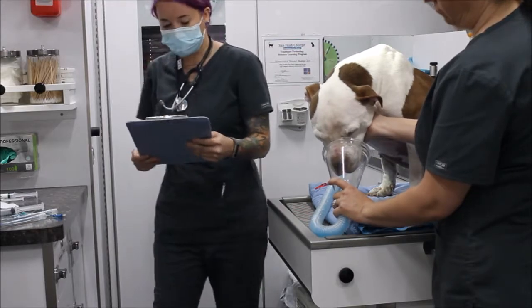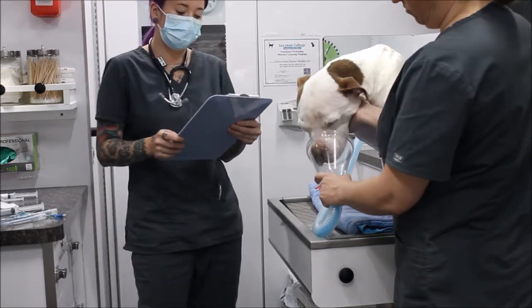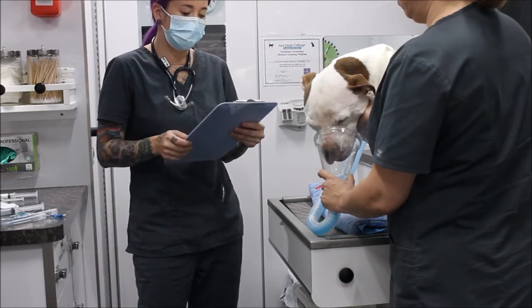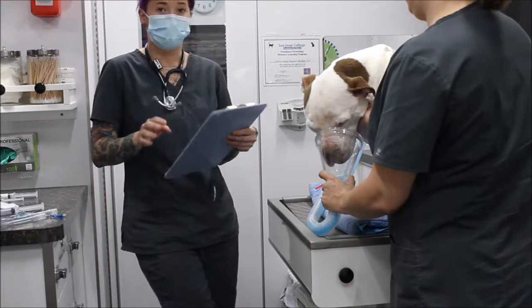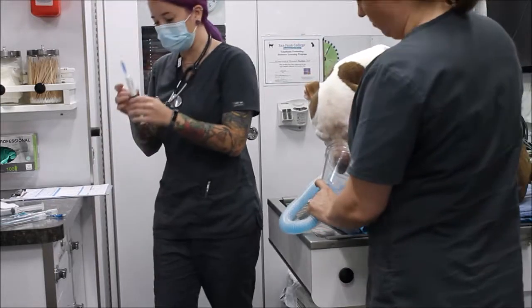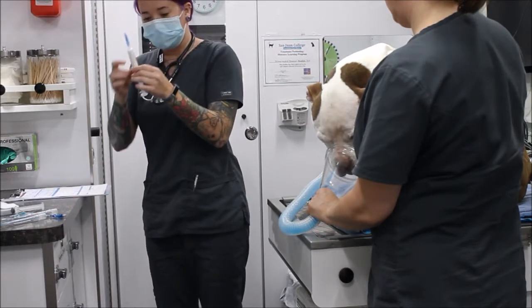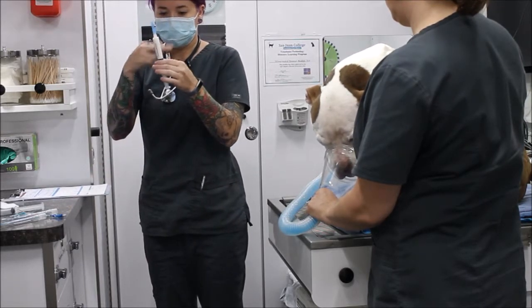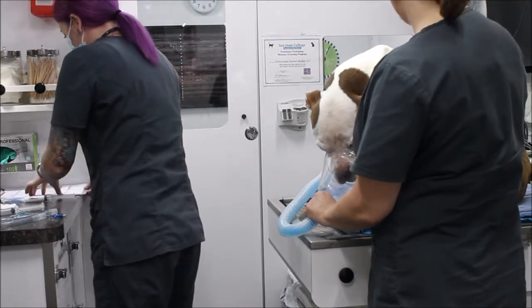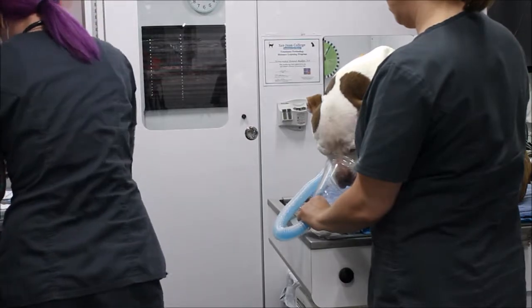Now I'm going to check his induction agent. We're going to be using propofol at 10 milligrams per milliliter and a dose of four milligrams per kilogram. For his weight of 29 kilograms, we draw up 11.6 mls of propofol, which we'll be giving to effect. I have my propofol here, I'm confirming the correct amount is drawn up in the syringe, and now I'm removing any air bubbles.